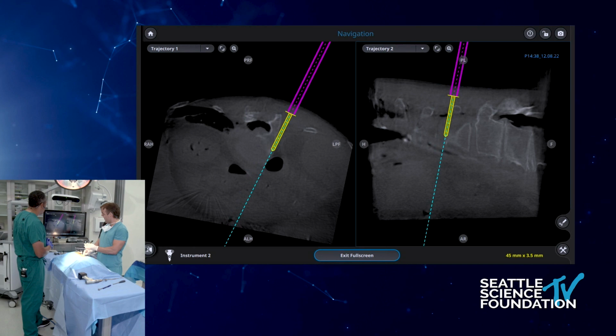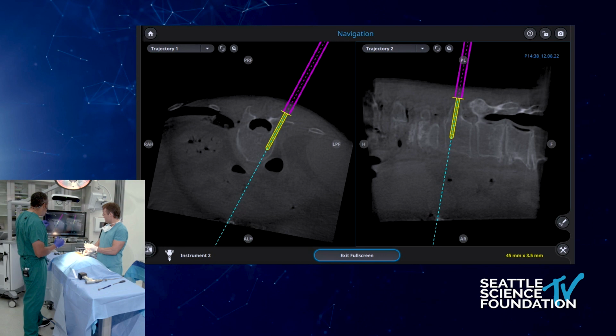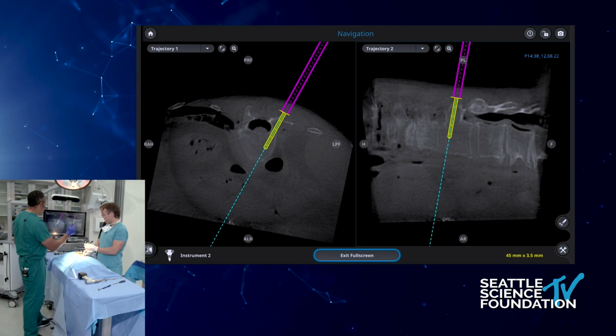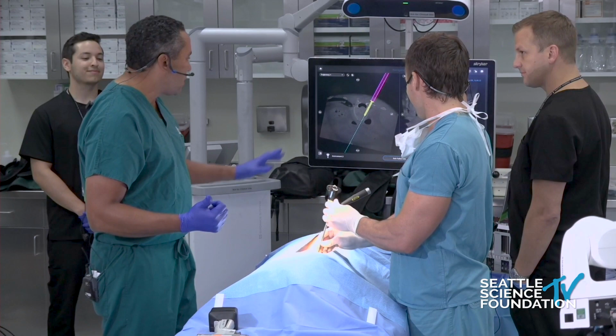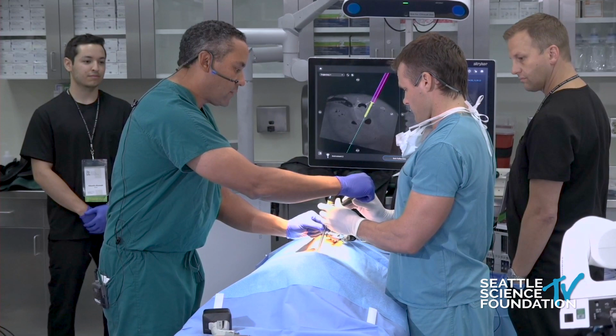And then maybe if you want to be just a millimeter medial. Yeah, yep, you feel that? I feel it. Okay, and then put your hand towards head, just a hair. Okay, so that's a nice trajectory, right? So hold this here so that you have good control of it. Okay. And you see how you moved just slightly.